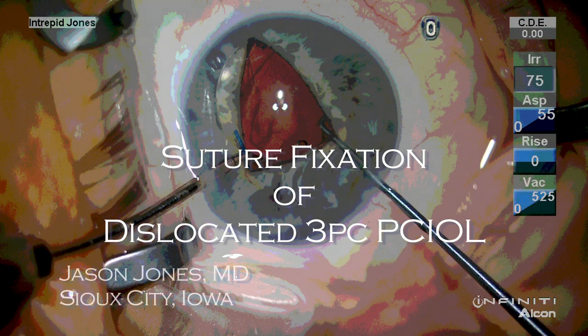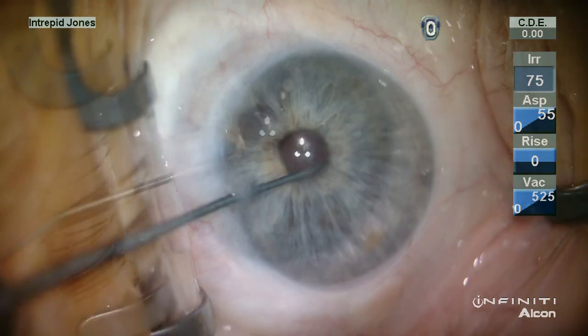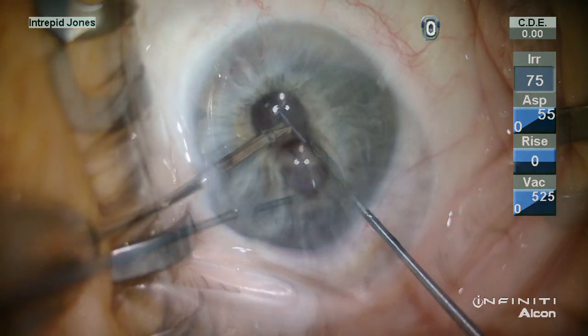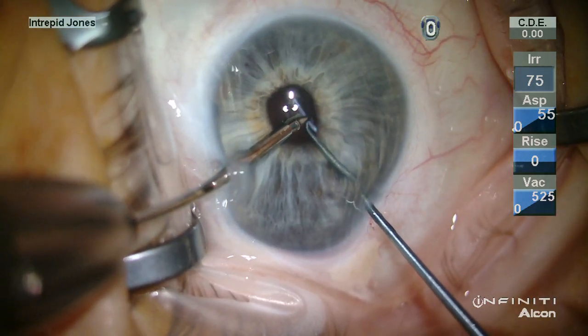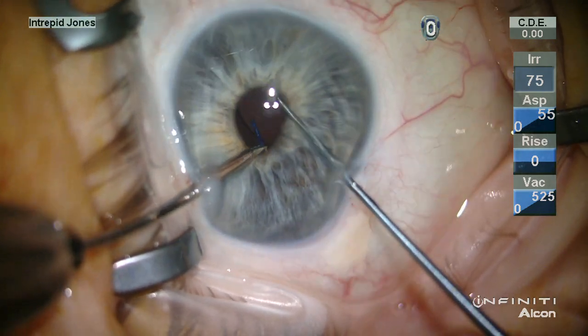This patient had a traumatic cataract removed approximately 25 years prior and did well for a considerable period of time. Over the past several years, his vision declined and he presented with a mobile lens, which appeared to be in the sulcus and no vitreous in the anterior chamber.